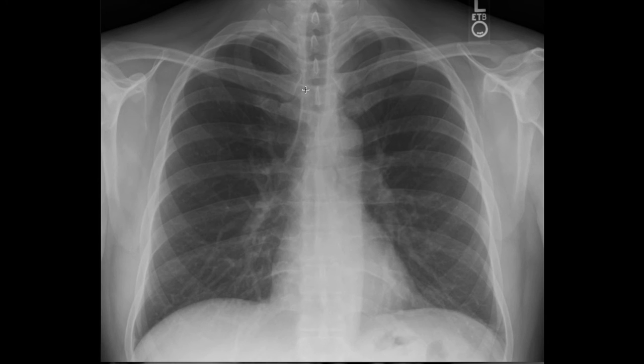Another part of the evaluation criteria is density. Now, normally we know that the lungs are full of air, so they should appear black. And the bone, since it contains minerals and is higher in density, should appear white. Now, it should not be black to the extent that it's burnt out, because we have to see the lung markings right here. You see the vascularity coming out from the heart.